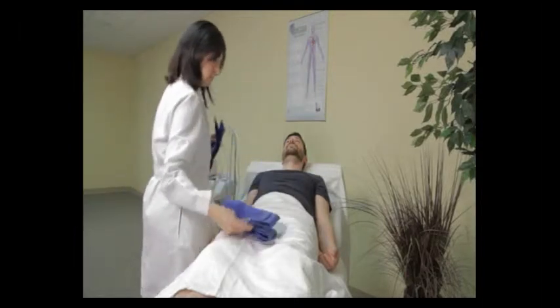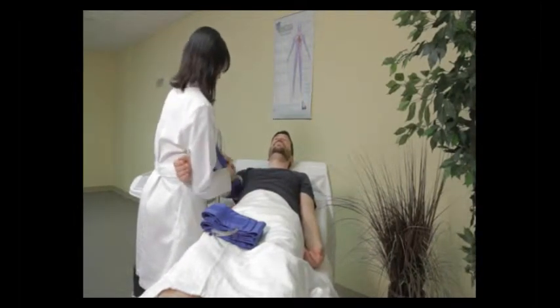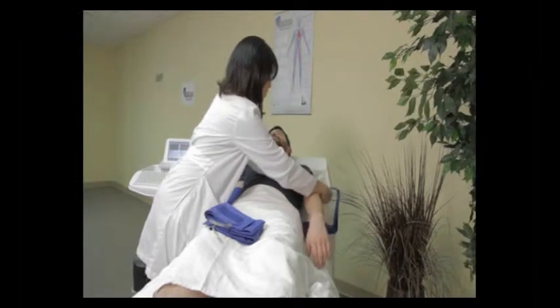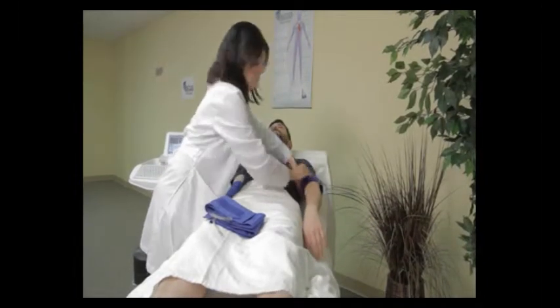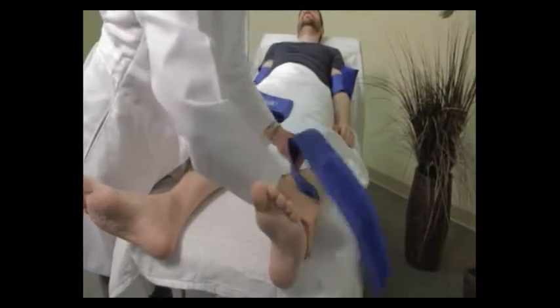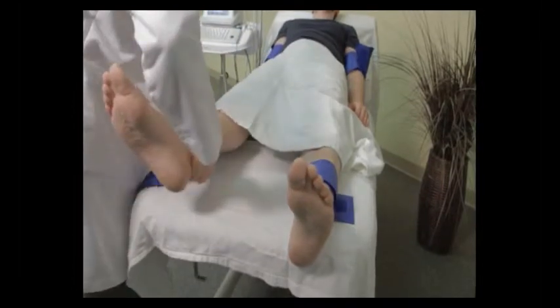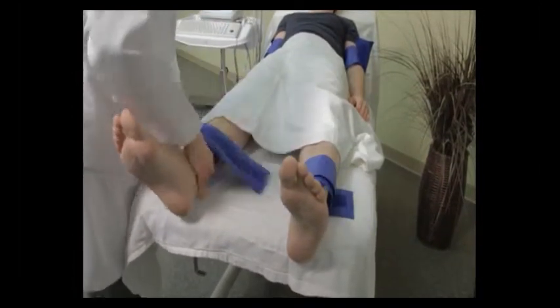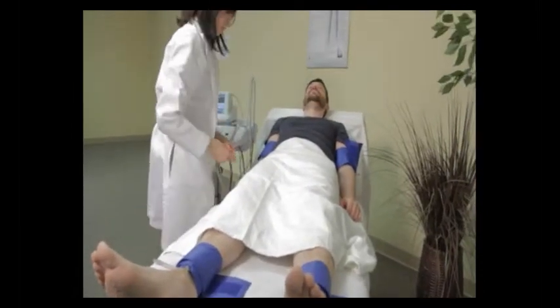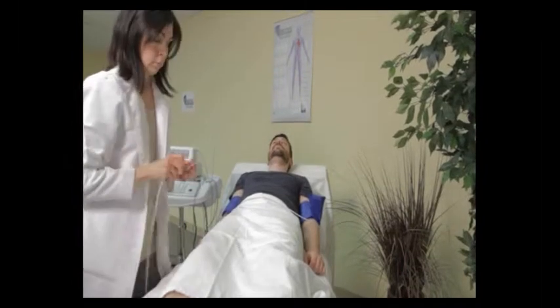She's going to start by putting the cuffs on the arms and the ankles. She's now attaching the hoses to the cuffs. The REVO 1100 has four separate pneumo hoses, one for each arm cuff and one for each ankle cuff, so you do not need to move hoses in the middle of an examination.